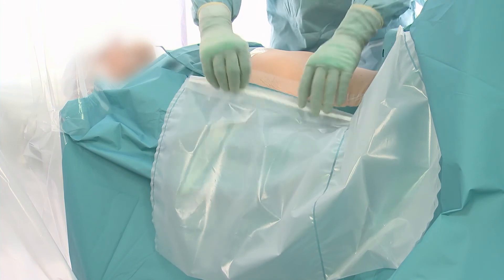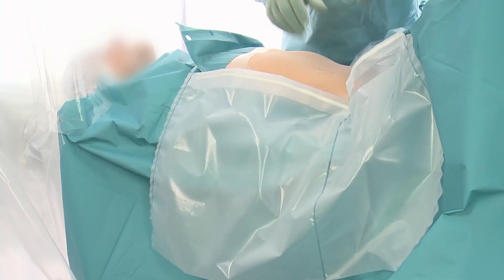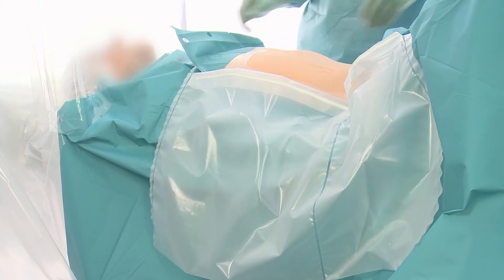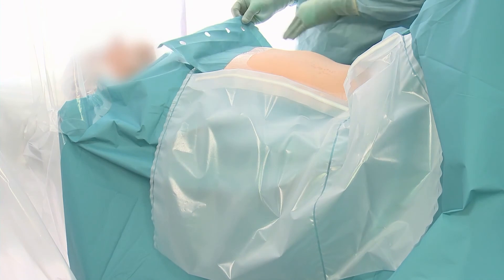Shape the pouches with the integrated flexi-wires. The drape also includes integrated tube holders for safe and efficient instrument handling.